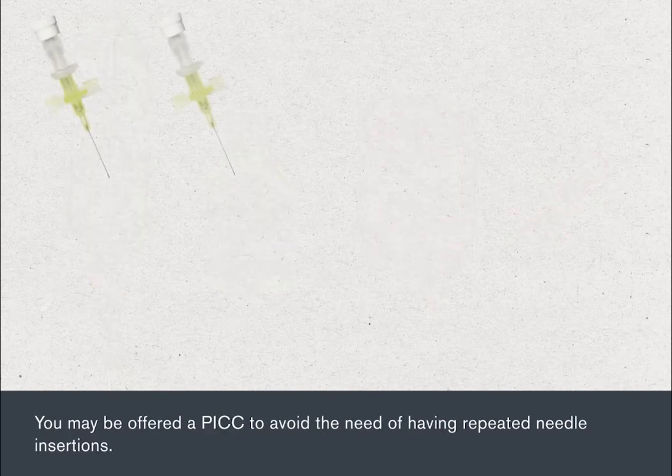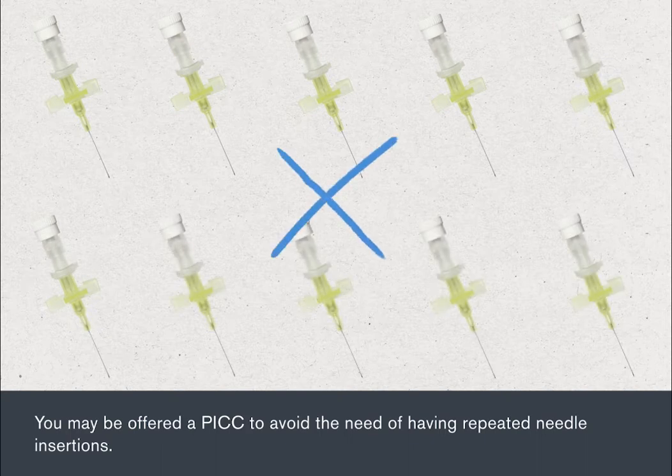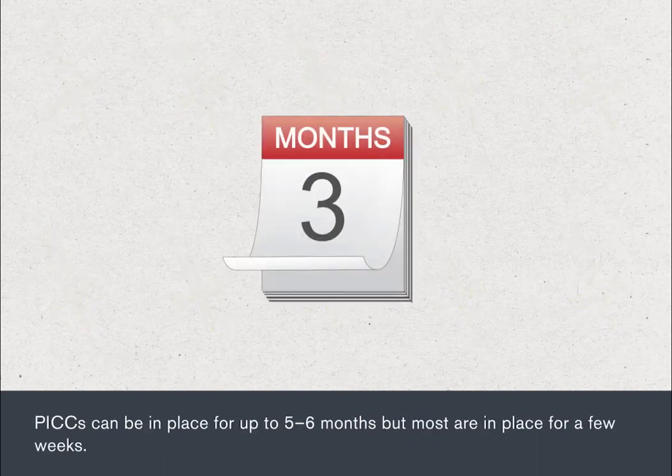You may be offered a PICC to avoid the need of having repeated needle insertions. PICCs can be in place for up to 5 to 6 months, but most are in place for a few weeks.